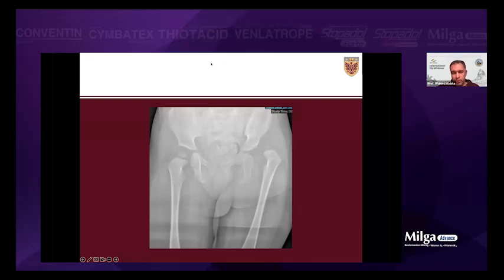So in my booking sheet, I asked for a flat top table, so I would be able to do X-ray on the table, and I also ask for small fragment plate and screws in case we do shortening. I asked for K-wires. I asked for the osteotomes, straight and curved osteotomes.